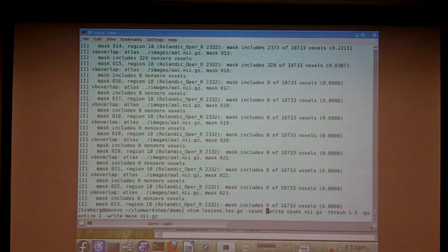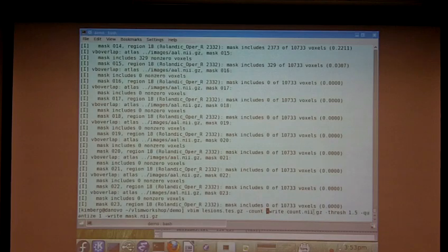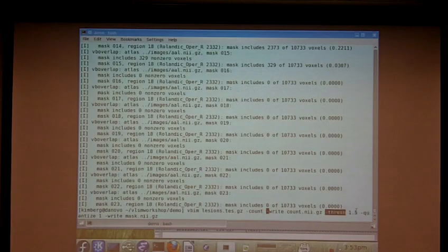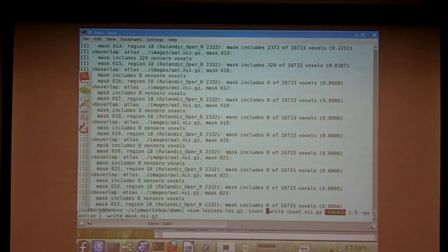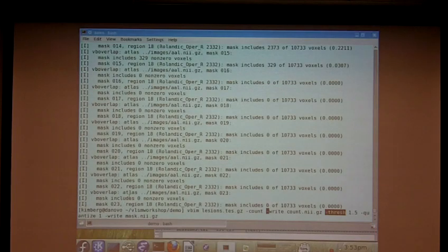But you can stack operators on top of each other. So after we do the count, we write that out to a file called count.nii.gz. Then we're going to threshold it at 1.5, which basically discards anything below 1.5.